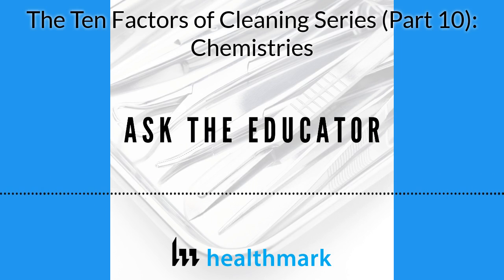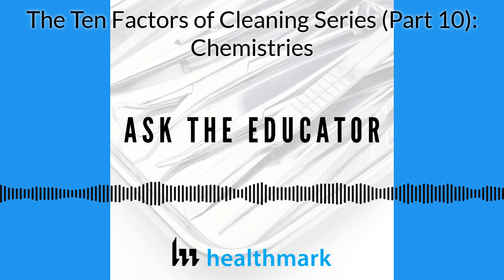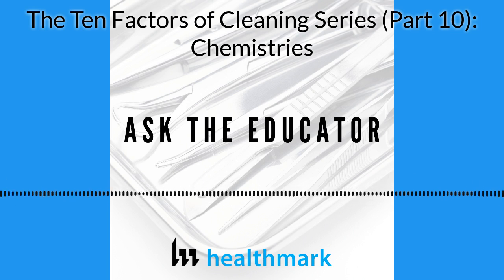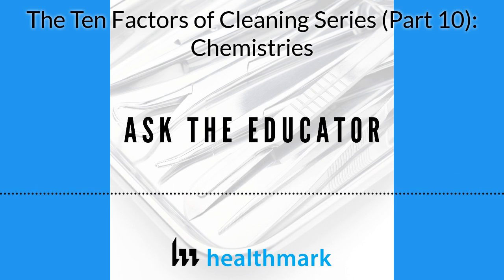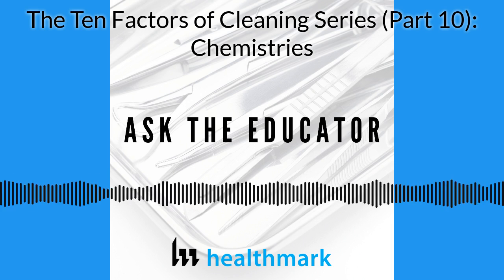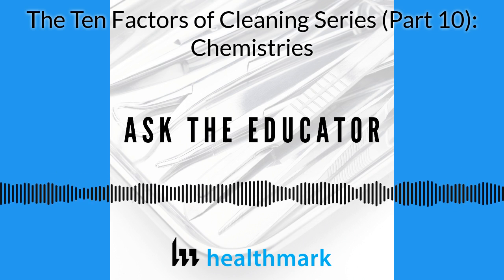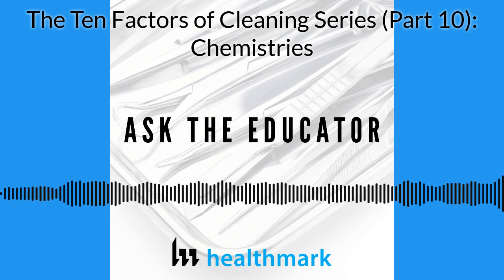And I'm sure, Kevin, you've had every salesman pitching their cleaning solutions to you and telling you about different things. But did the term surfactant ever come up, or something you had to look into to understand that cleaning solution? Actually, now that you mention it, yeah, we were very familiar with surfactants in our department, only because the company Stryker had come out with one of the first cleaning detergents known to me that was surfactant based, meaning there were no enzymes in it.